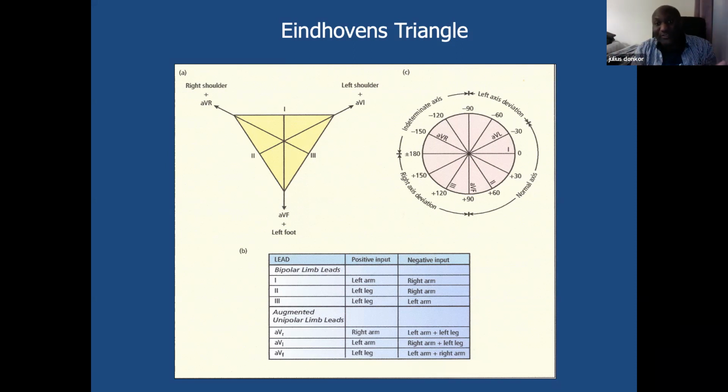Sometimes you might even use this when somebody has got heart failure, by changing the LV RV pacing offset. You keep changing it, where -5 milliseconds, -10 milliseconds, -20 milliseconds, and see how the QRS narrows or changes into right bundle branch in V1, and lead 1 becomes more right axis, like more negative. So some people say some patients can respond better with this. Some doctors think this is completely rubbish.